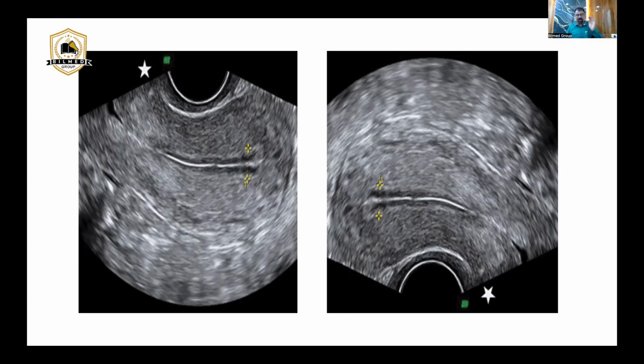So, for example, if you have hepatitis in your patient, will the liver increase more in length or in anterior posterior diameter? In your comment boxes now. Repeating the question, in hepatitis, what will increase more, length or anterior posterior? Dr. Vandana Gupta, very good. I got the answer. You posted length. So I have to see in longitudinal section. In length only.